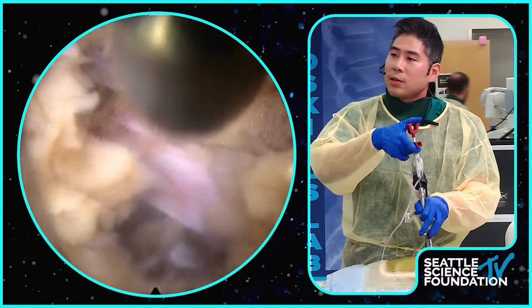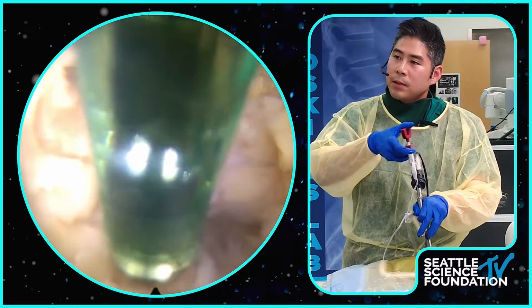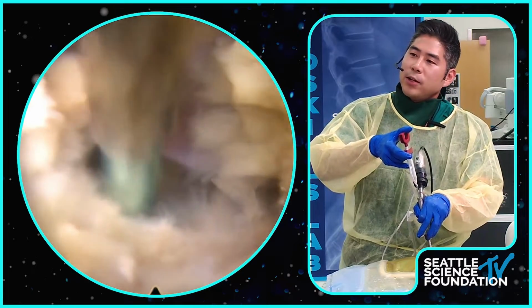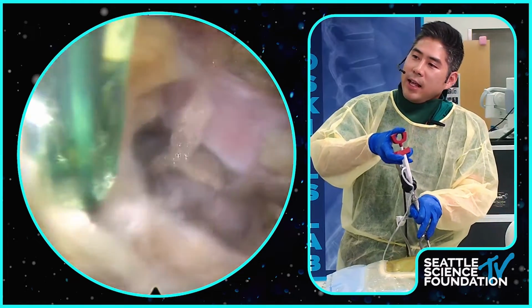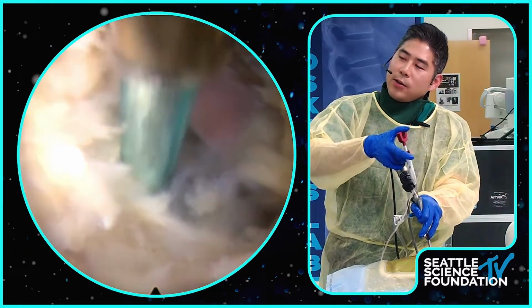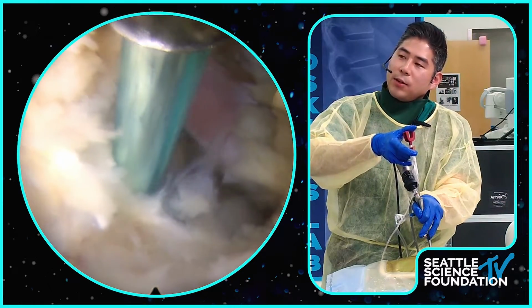Show us. Where would a transforaminal endoscope come in, like an approach? Where would you see it in your view right now here? So it will be coming through here. This is the foramen right here. So this is the traversing root. This is the disc space right here. And then the endoscope. So this is a facet joint. So your endoscope for the transforaminal will be coming through here.